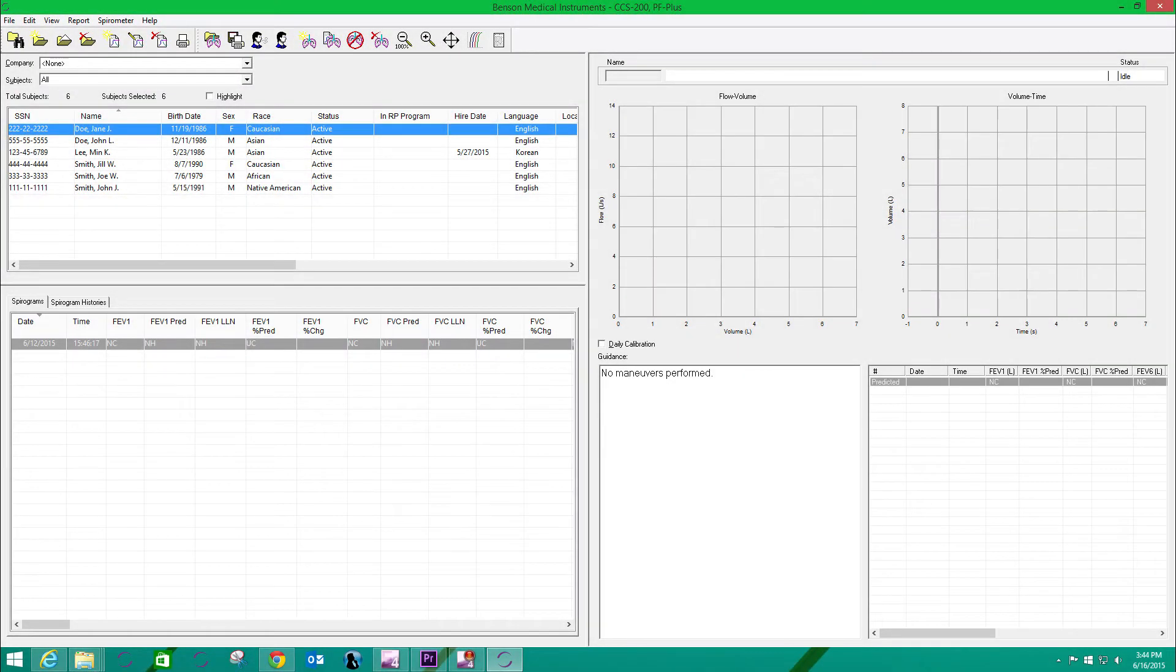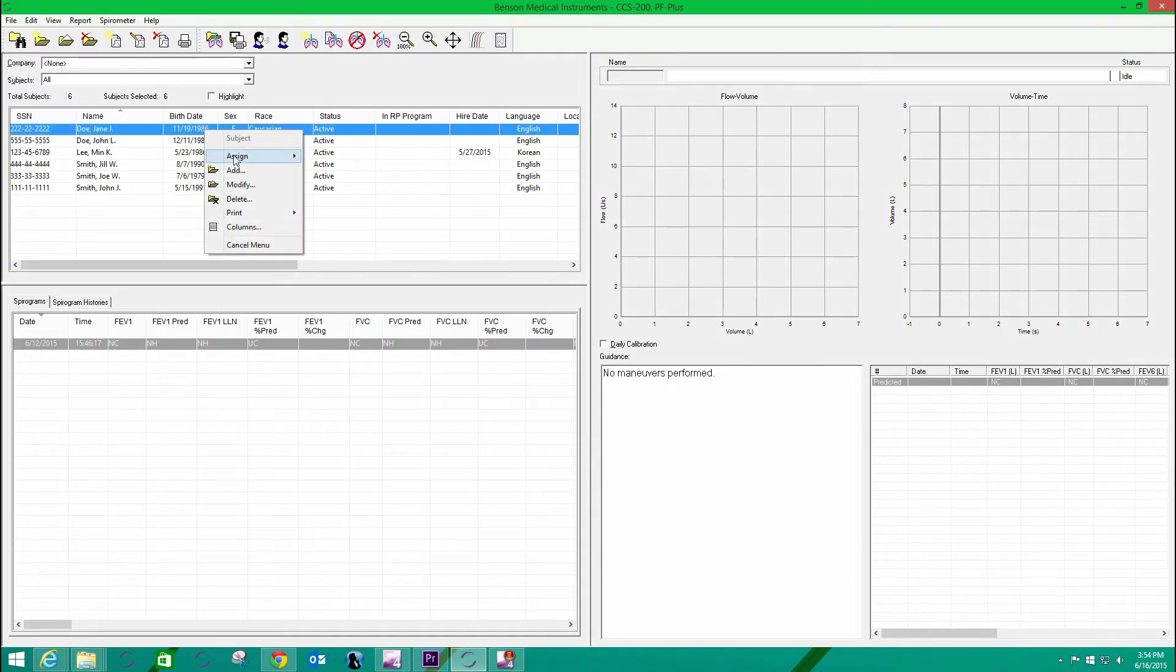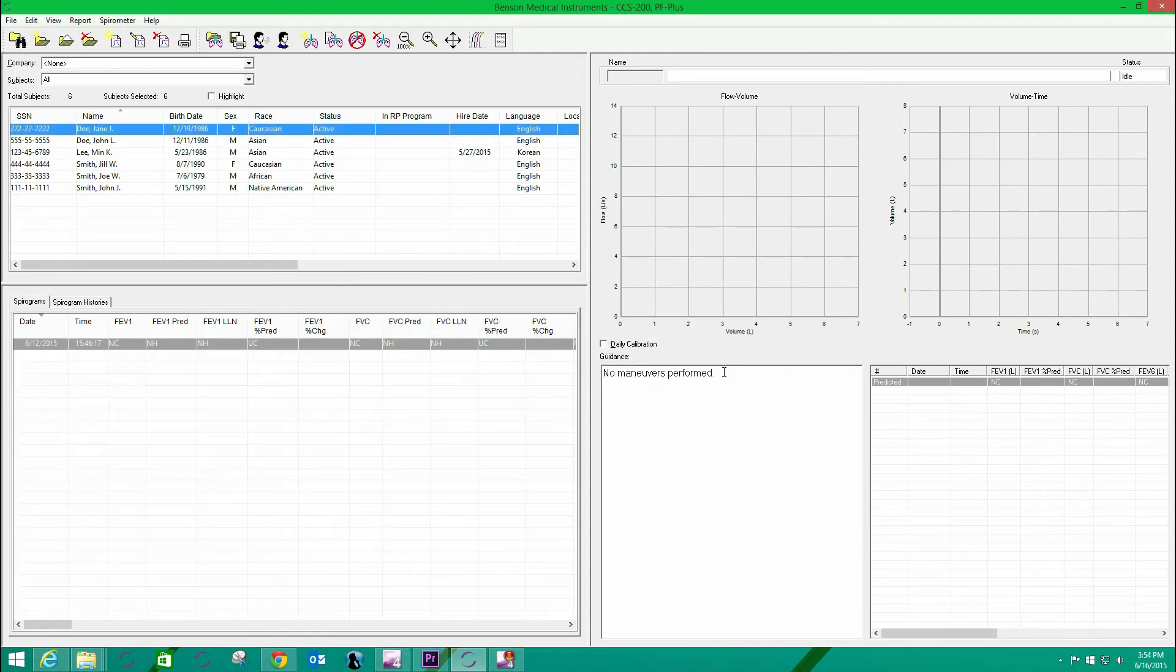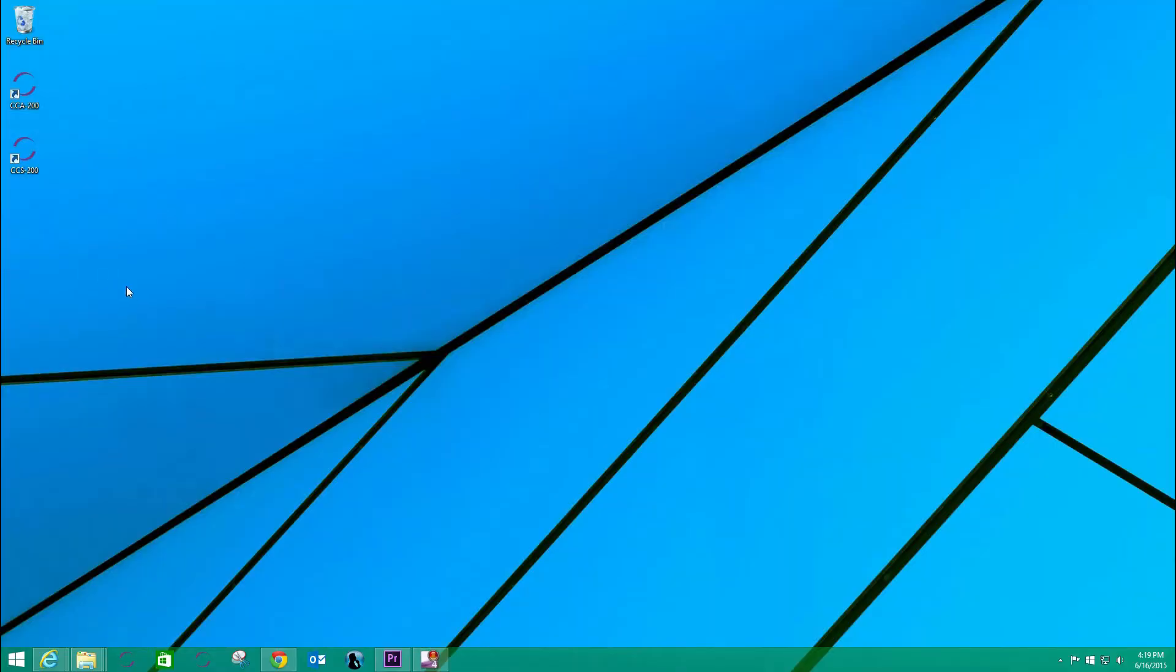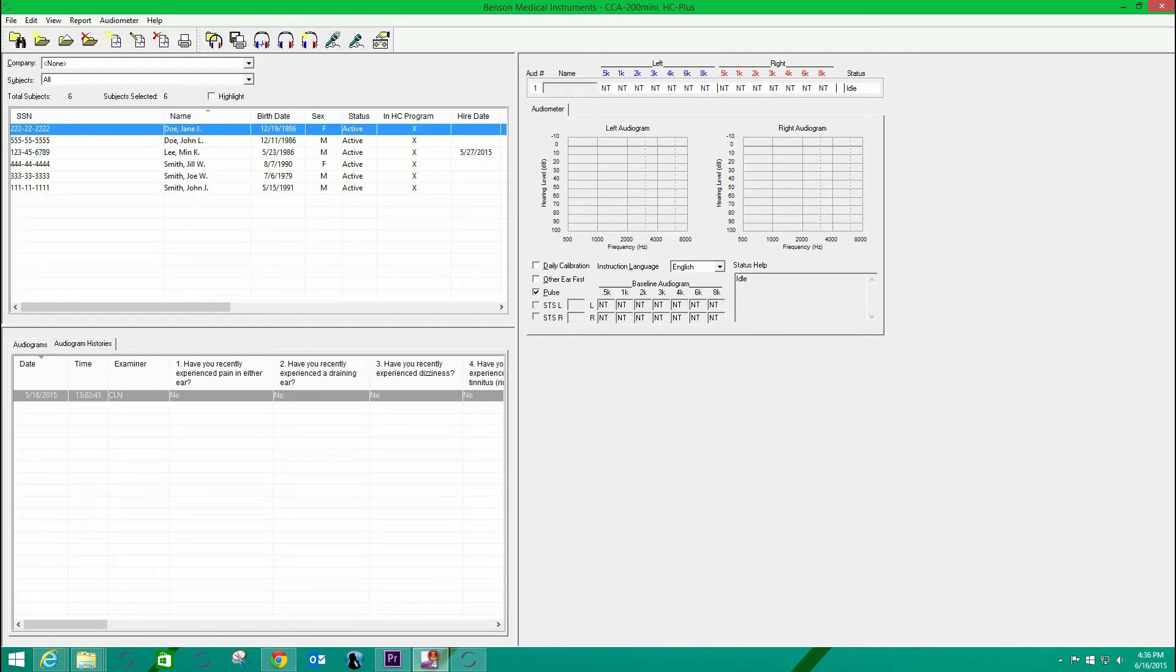Even though I am running the software application separately, they are both using the same database. I will demonstrate this by opening this test subject's demographic record and making a correction to the birthdate field. When I close the CCS200 and reopen the CCA200 mini, you'll notice that the field is changed here too, because it is in the same database.